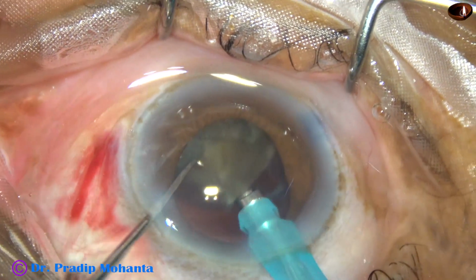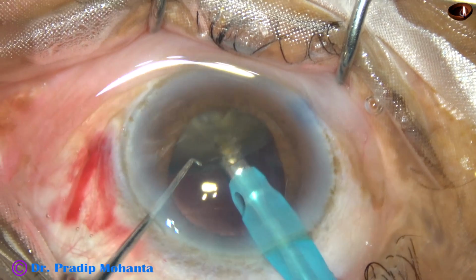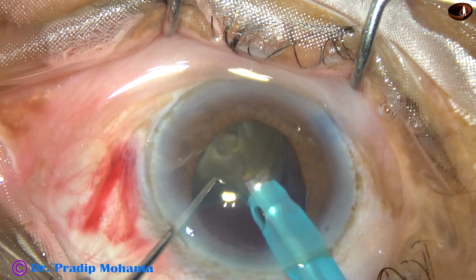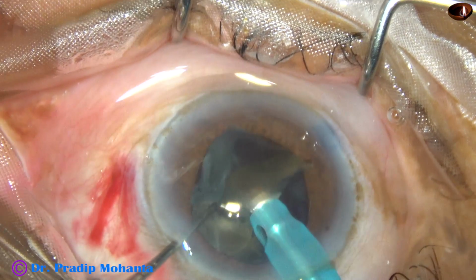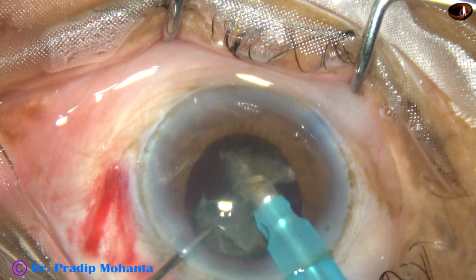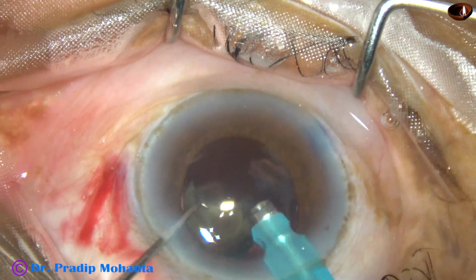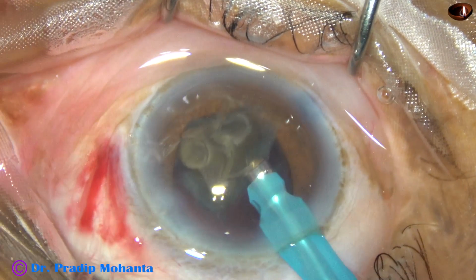And now we're towards the end of the nucleus management. See, I am tilting the nuclear piece, going to the apex, applying some ultrasonic energy there, and if there is some joining band between two fragments, that particular band gets emulsified and the nuclear pieces become free.